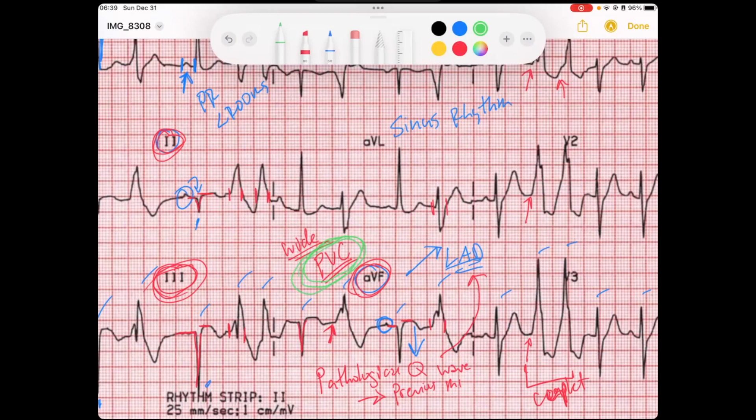If you notice, these couplets are back to back and very close to each other — definitely something we would worry about for someone going into ventricular tachycardia from these proarrhythmic ventricular cardiac cells.